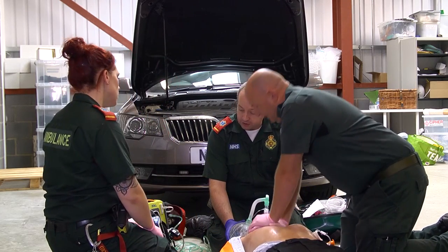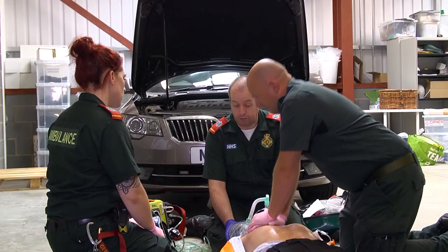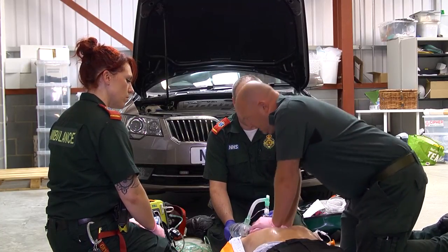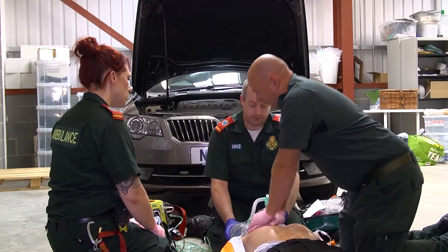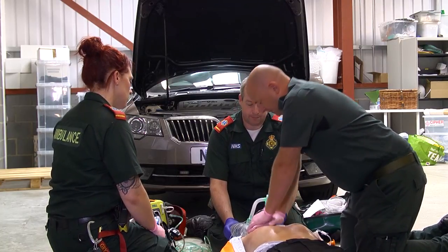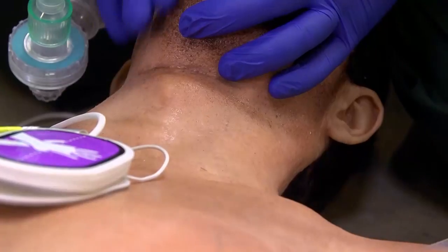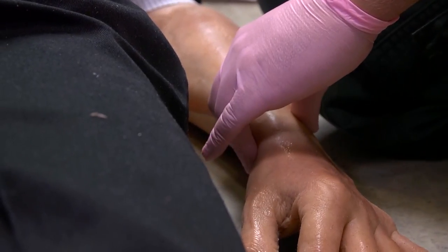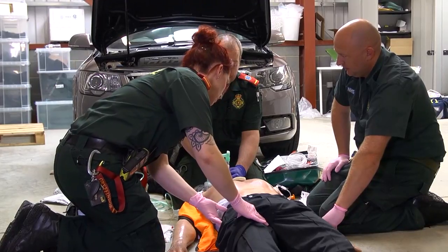If, when we stop, that certainly does look a good rhythm. Can you check a femoral pulse? I'll check a carotid. Mm-hmm. Ten seconds. Five, four, three, two, one. Yeah. Okay, I've got a carotid pulse. Yeah, I've got a weak radial. Yeah. I've got a femoral. Excellent, brilliant.